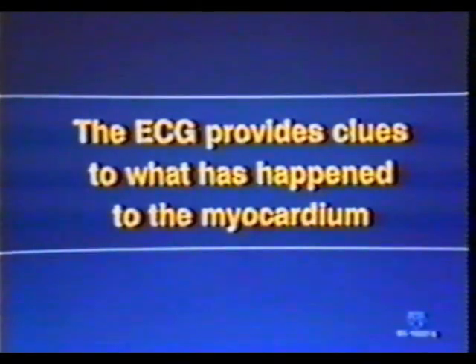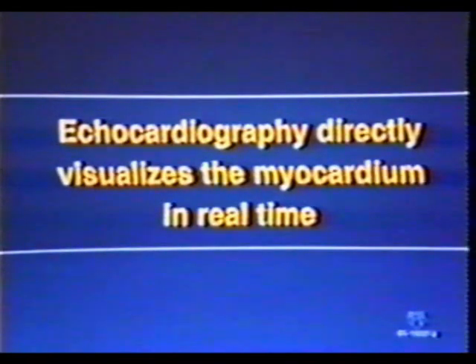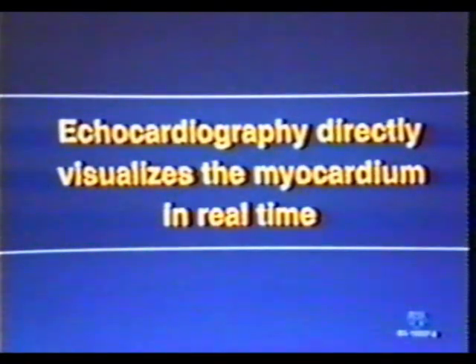The ECG is usually useful for determining the acuity of infarcts. Through the years, the ECG has also served to provide useful clues to the extent of myocardial involvement. Echocardiography directly visualizes the myocardium involved in the acute infarction. We are trying to salvage myocardium, not ST segments. Therefore, it makes sense to make our management decisions during acute infarction with full knowledge of global and segmental LV function.